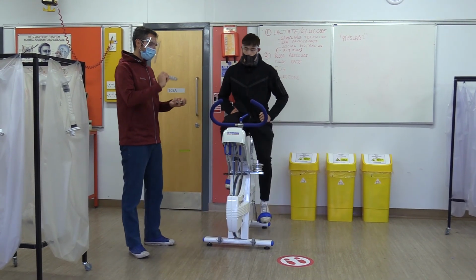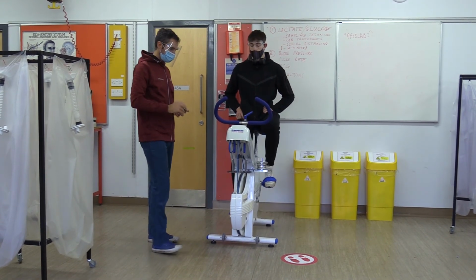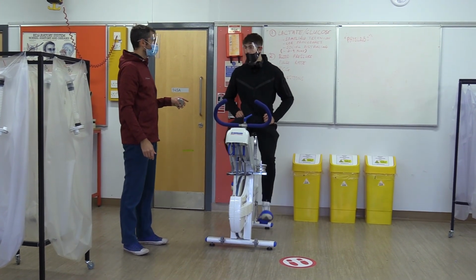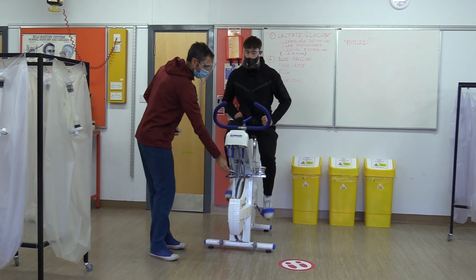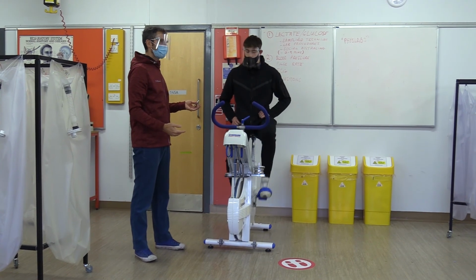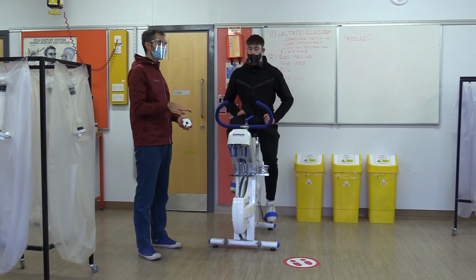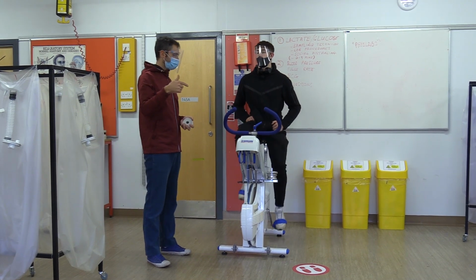Okay, that's almost at your first stage. So, if I put this one on, so 0.5 kilograms, that's the basket, that is now 90 watts. So that's a little bit harder, Will. Okay. Then, obviously another one on, that would be 120 watts. Okay, and they should feel it's a little bit harder. Okay, so when you're actually doing the test, the first stage should be really, really straightforward, really, really easy, and get progressively harder at each 3-minute stage.